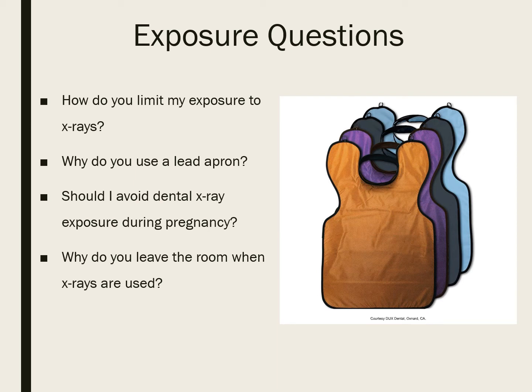However, most offices, and Concord as well, are basing our recommendations on tradition and the comfort of the dentist. And so some dentists, in order to make our patients feel more comfortable, postpone x-ray procedures unless it is a critical or an emergency situation.